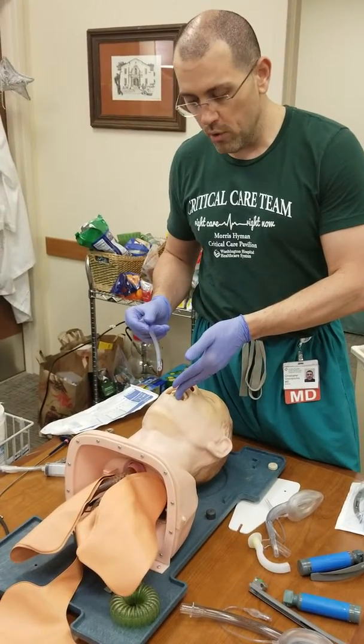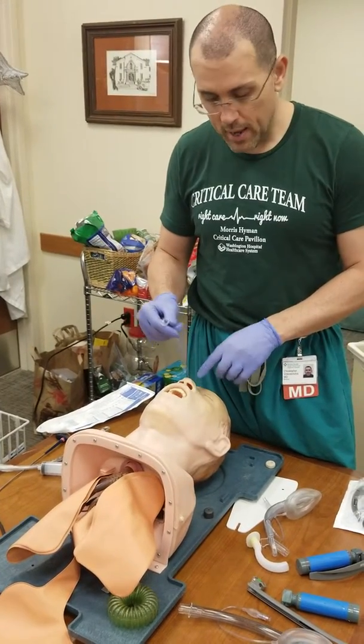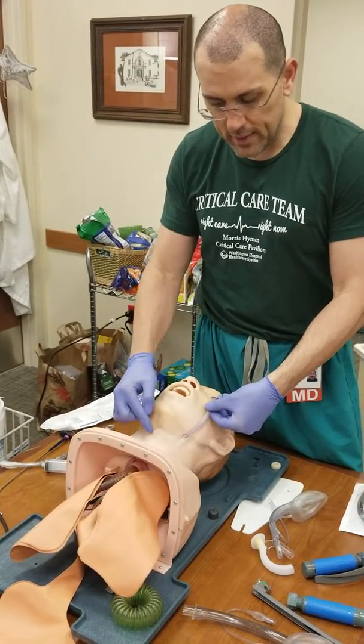You can go through the mouth with an oral airway, or with a nasal trumpet you go through the nose and have it open so that the tip is right in front of the glottis, giving air in.